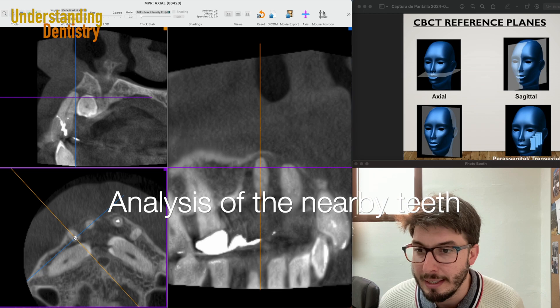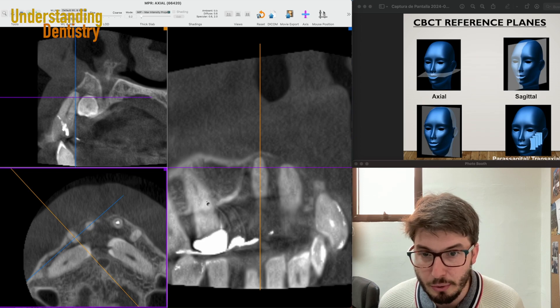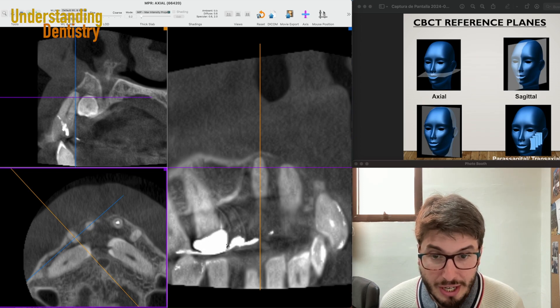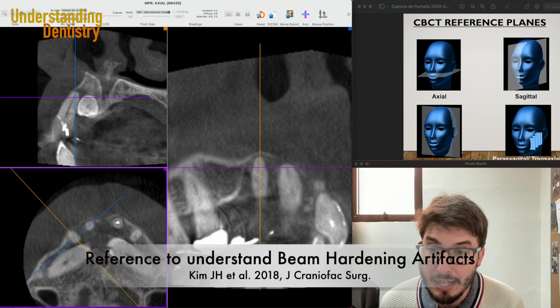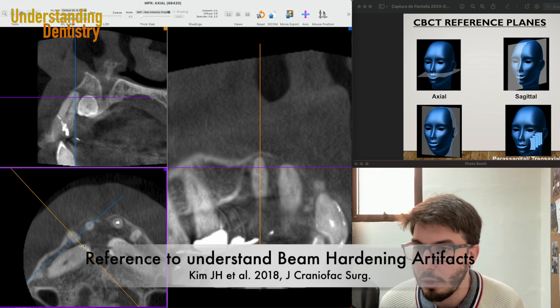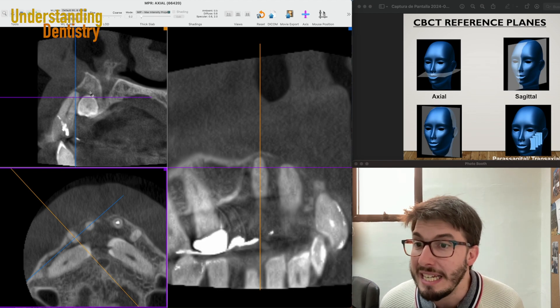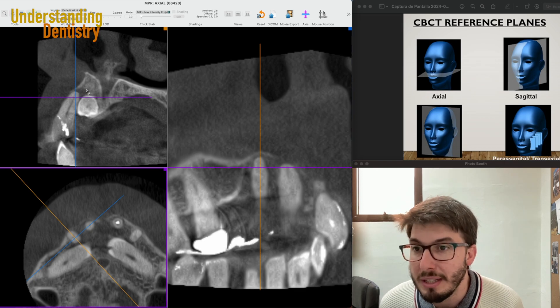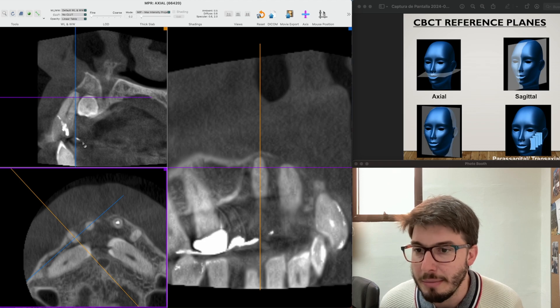Let's analyze the incisors first. We have the right lateral incisor, and there are even beam hardening artifacts from metallic restorations and metallic crowns — that will be the topic of a future video. The lesion appears pretty much well-limited, homogeneous, well-defined, and somewhat rounded in shape.